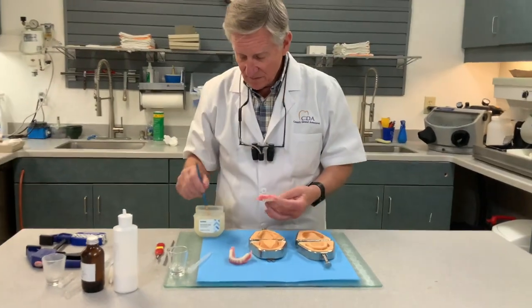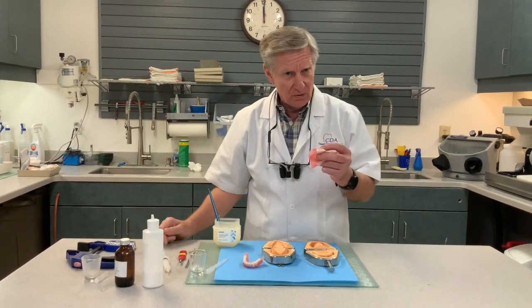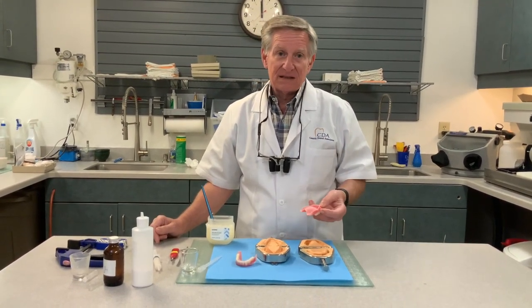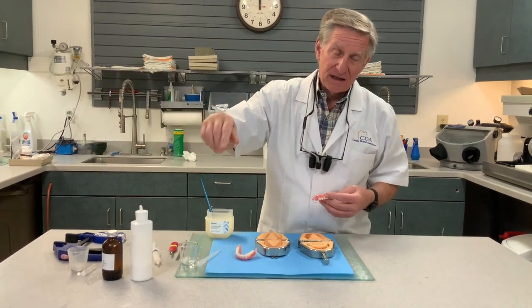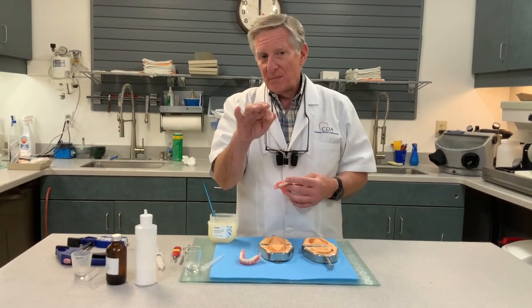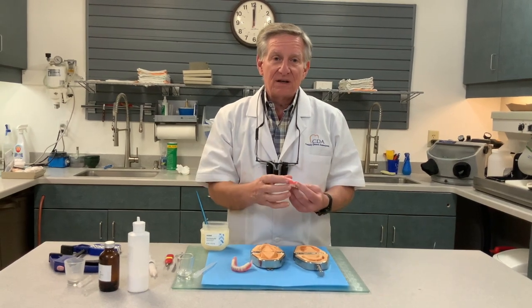Kathy's putting Miss Reed in. She has already mixed the flow cast and put it in a MonoJet syringe for each one. What we're going to do is put our duplicates in the flask with flow cast so that we can provide Miss Reed with a flow-cast duplicate of what she's been wearing. Now, if you give the patient back their old denture, the problem is it's going to beat the tissue down and cause the same problems they walked in the front door with. So I would encourage you to make them a duplicate.